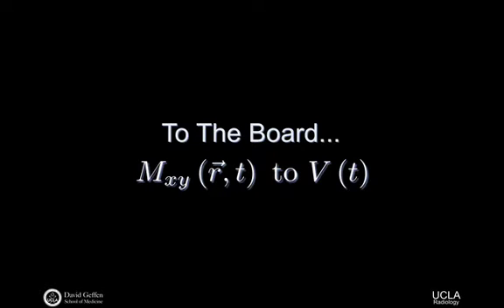So then what you have in front is a 1 over T2 term. If we look at, say, comparing just that term, leaving the exponential, just comparing the 1 over T2 term to the omega as a function of spatial position, these are the principal differences between these two terms inside the big bracket, in terms of things that have magnitudes. How does the magnitude of 1 over T2 star compare to the magnitude of omega?